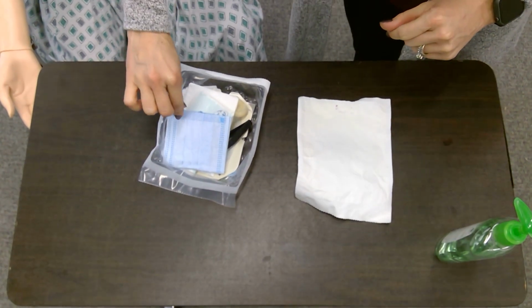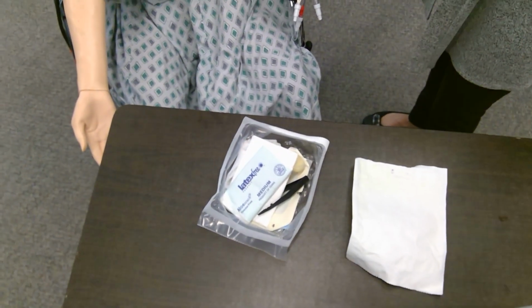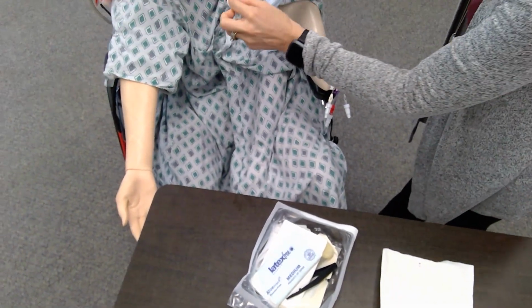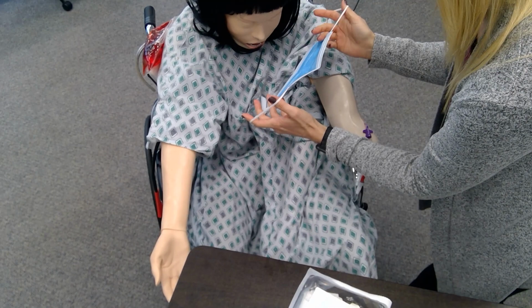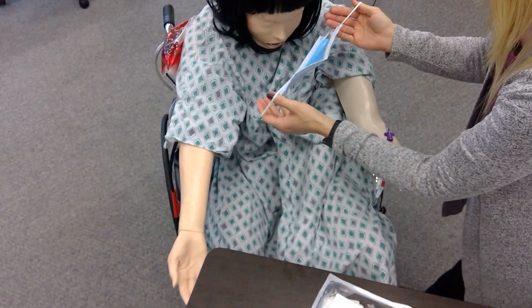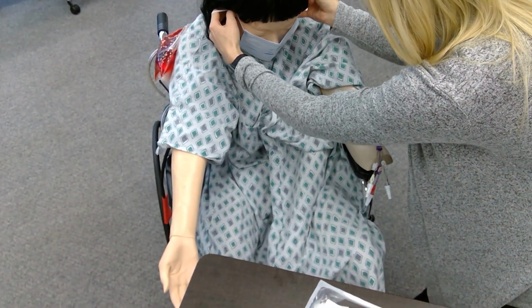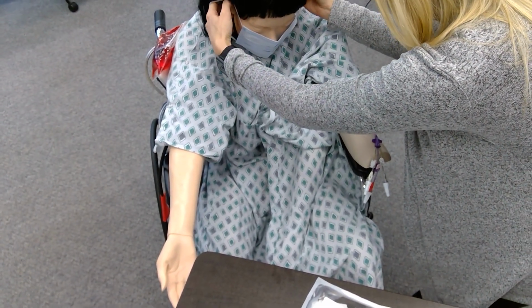First thing on top is the mask, which I'm going to remove and put on Sarah. Sarah, I know it's going to be a little bit uncomfortable, but I'm going to put this mask over your nose and your mouth, and that's just going to keep you from getting any germs on your site, okay? That's fine. I wouldn't want to cough on it, and I've had a little cough.